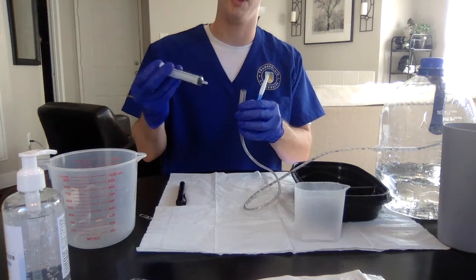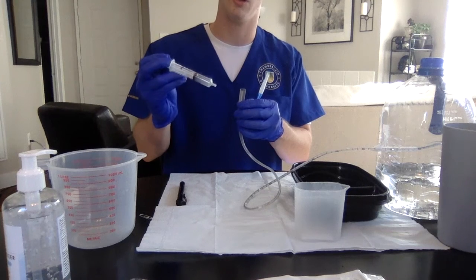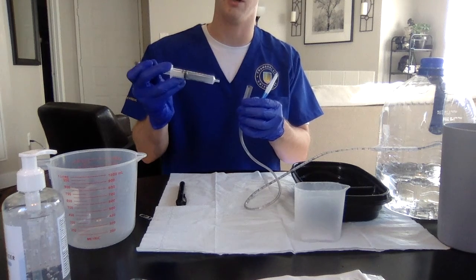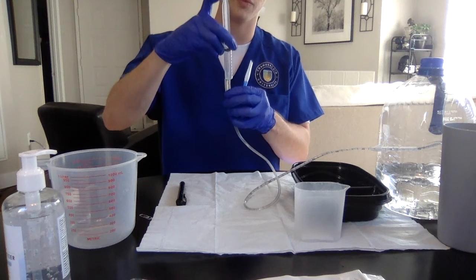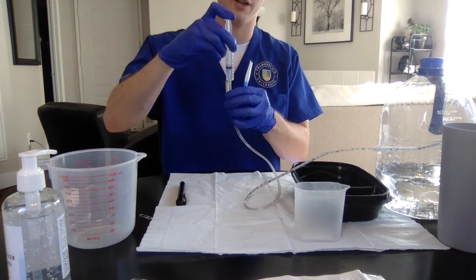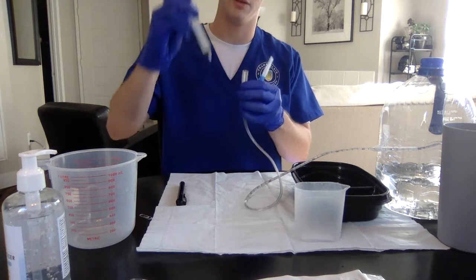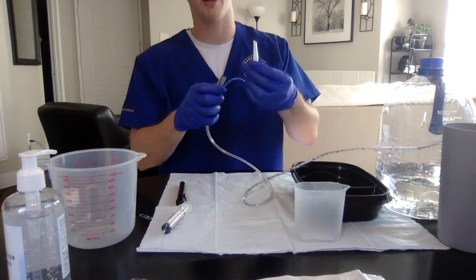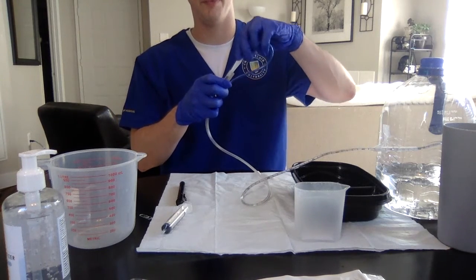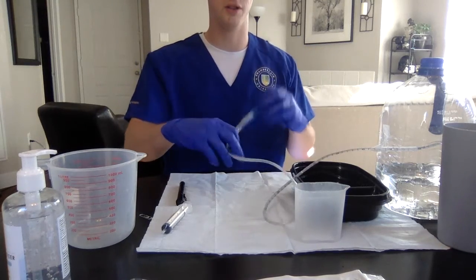And then now we're going to remove this, and we're going to insert around 20 milliliters of air in order to clear the rest of the gastric secretions out of our tubing here. So we're going to insert this here. We're going to push the air down in. All right, so now we push the air through. We are going to be able to connect our connector back here. Secure this here. So now this is all closed up.